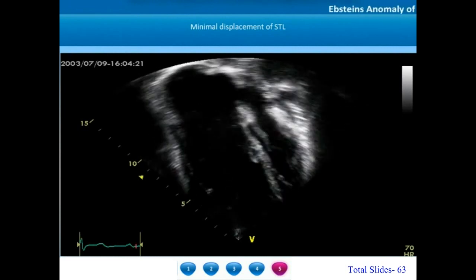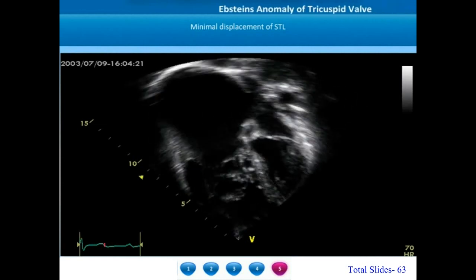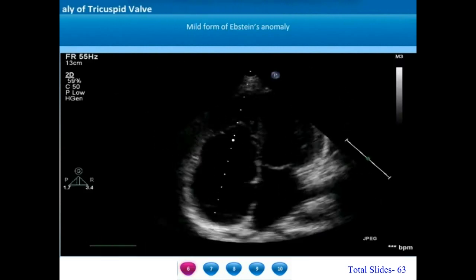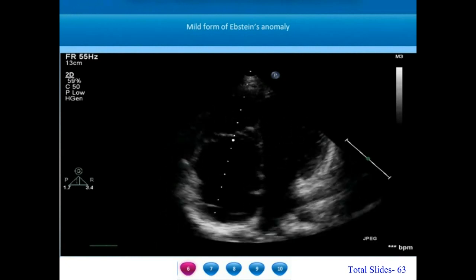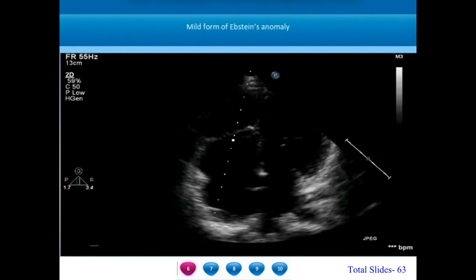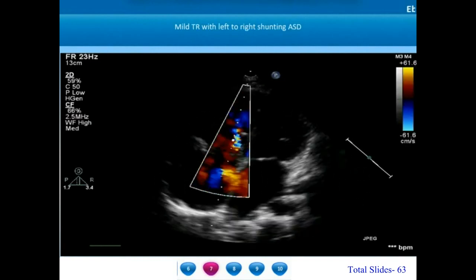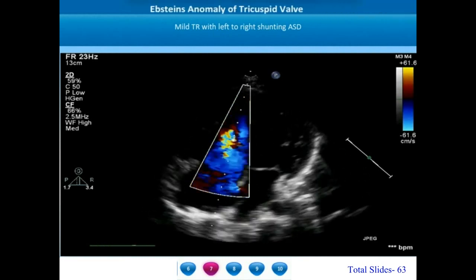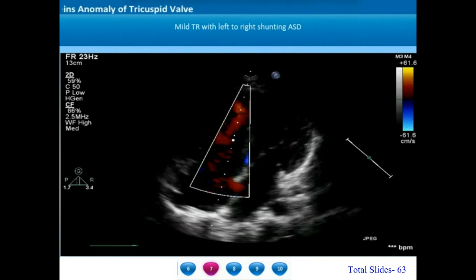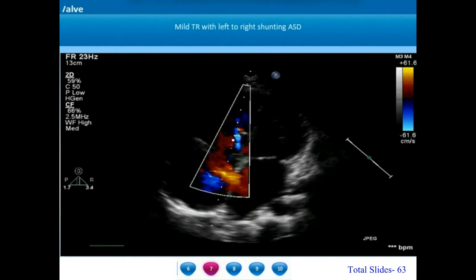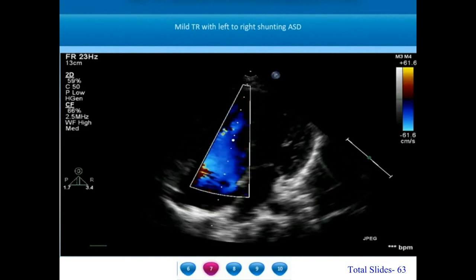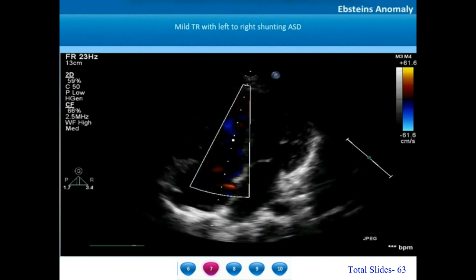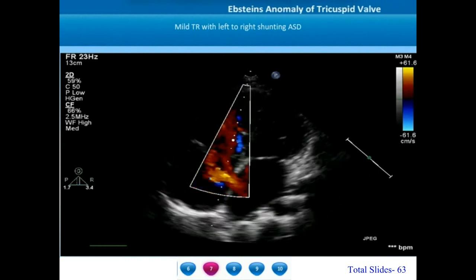In almost every patient with Epstein's anomaly, there will be a dilatation of the right atrioventricular junction. In this Carpentier type A patient, there is a small atrialized right ventricle and a mild narrow jet of tricuspid regurgitation. There is also a small atrial septal defect. Since the abnormality of the right ventricle and tricuspid valve is not very marked in Carpentier type A, most atrial septal defects will be shunting left to right.